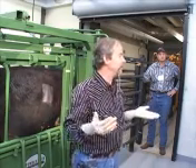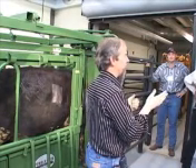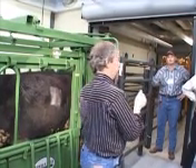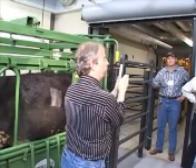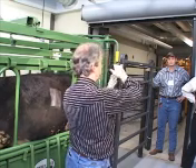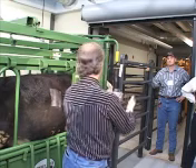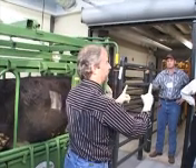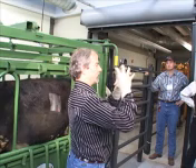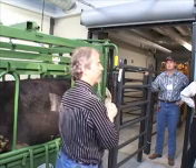Do not attempt it on the left side, because the rumen pushes the liver to the right. If you attempt to go in on the left side, if you get a liver biopsy you'll be extremely lucky. Because if you've ever looked at the animals opened up on a post-mortem, the liver very rarely will cross midline to the left side — it's almost always from midline over on the right side. It also has that cup in the side of the liver where the rumen is pushing on it. So you're shooting at a target that not only doesn't cross midline, but may be very narrow — where the liver on the right side may have that much larger a target to it. So it would be very difficult and very risky doing a biopsy on the left side.